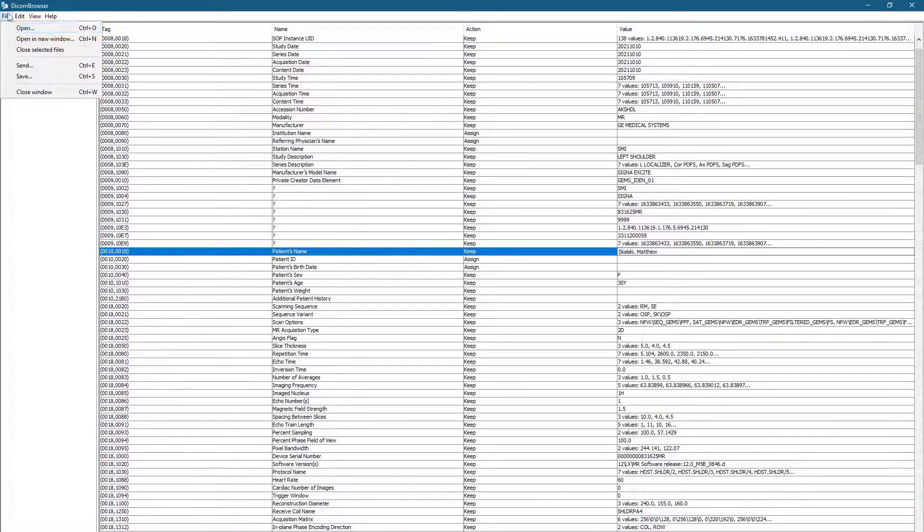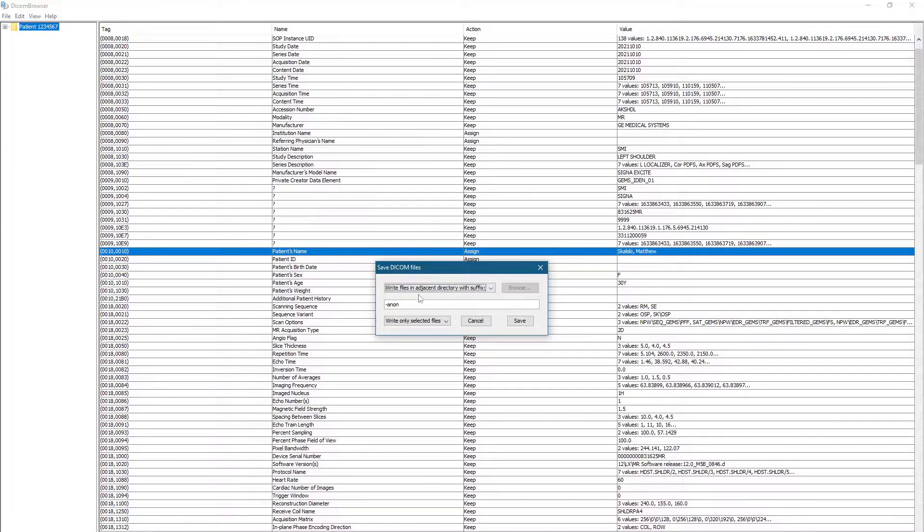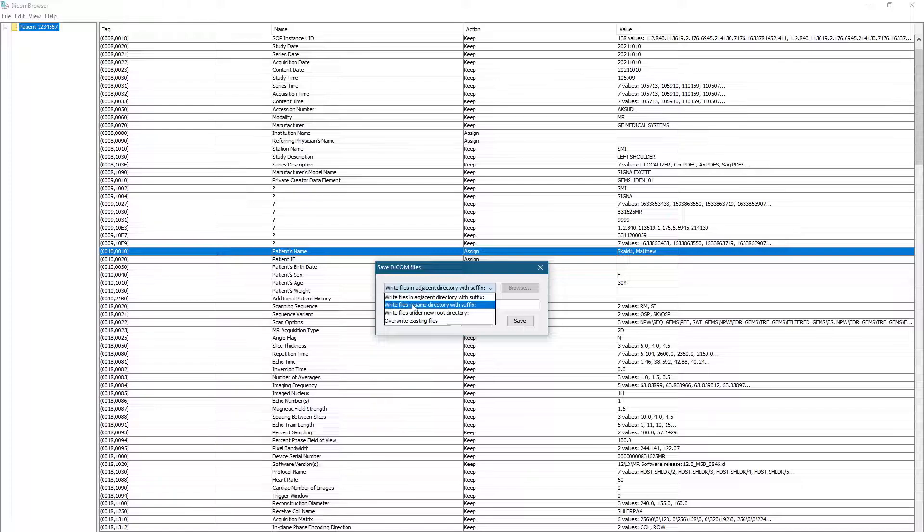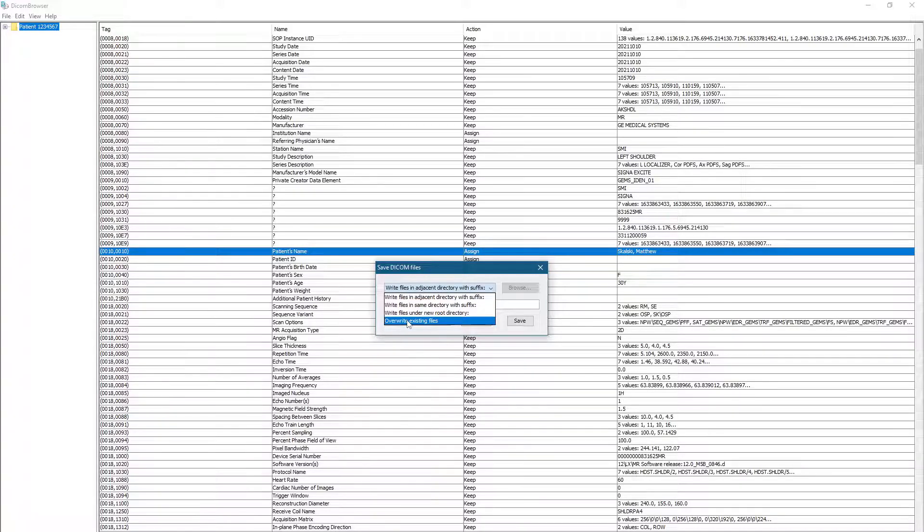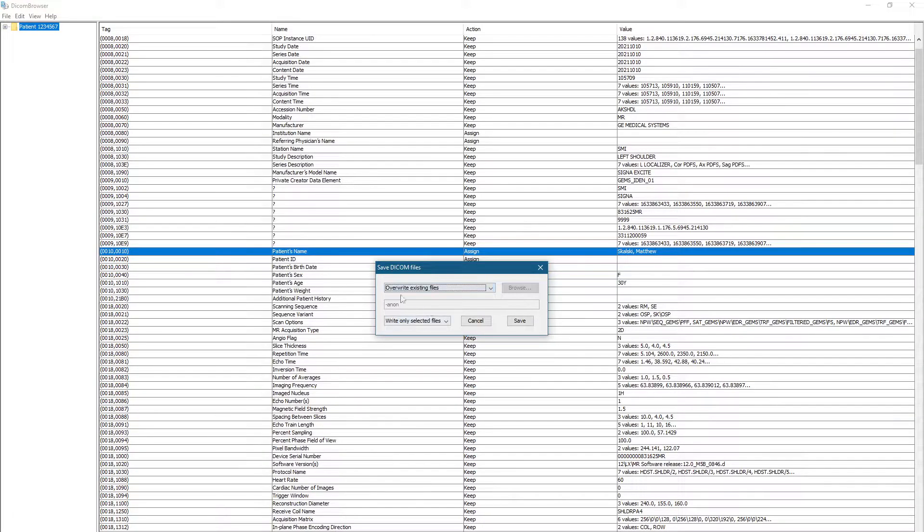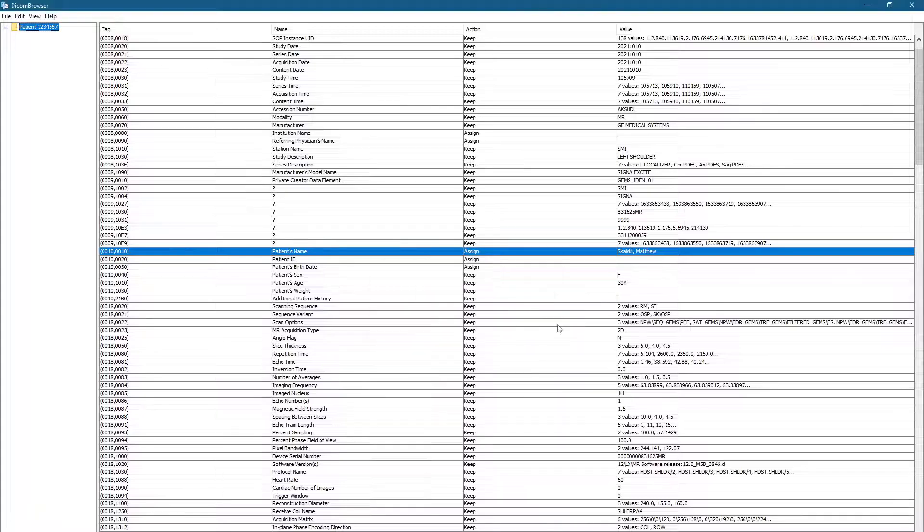And when you're done, you can go File, Save, or hit Control-S, and it's going to give you some options here. So you can overwrite the files, which is what I typically do because I've copied the folder somewhere new. You could also write them under New Root Directory, et cetera. So I've already copied and pasted this folder on my desktop, so I'm happy to just overwrite them.